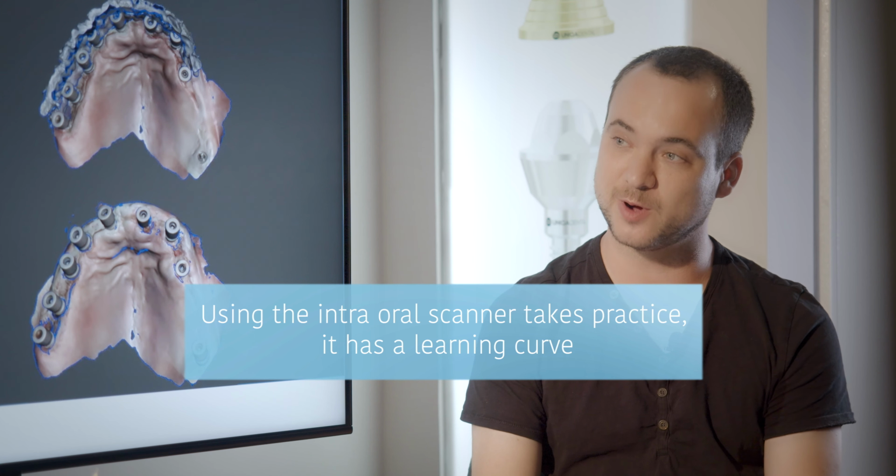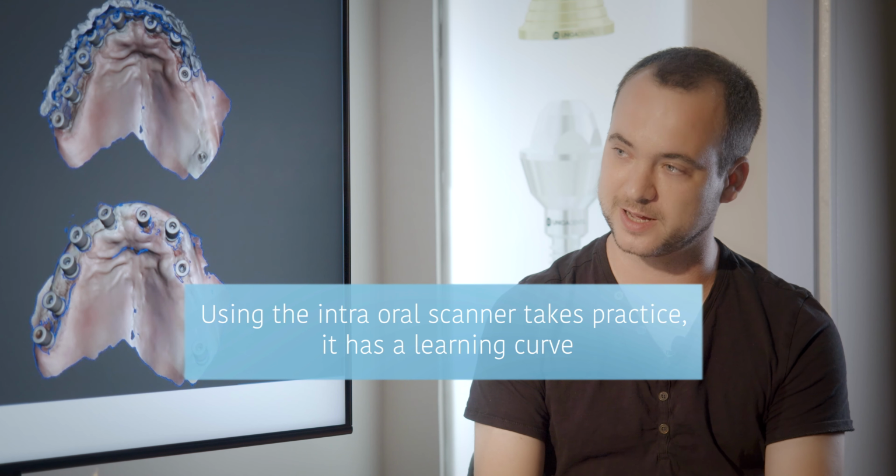You need to have some learning curve. You need to start with something small and learn how it works, because there are some things you can do to ease the work. With time, you understand that you need a dry gingiva for the gingiva to scan better. The upper jaw is much easier to scan because of the hard palate. In the lower jaw, you have the tongue, a much smaller jaw, and many times the gingiva is moving. So for the scanner, it's very hard to scan.